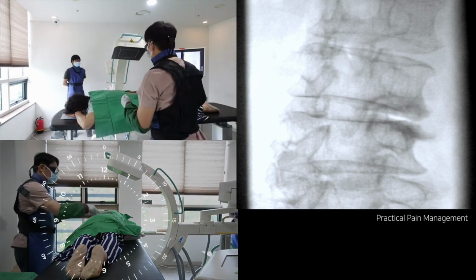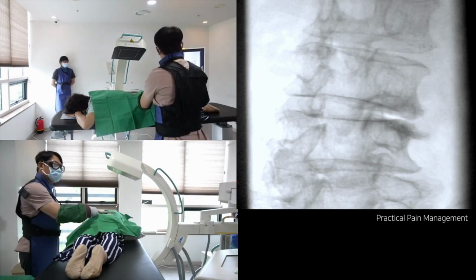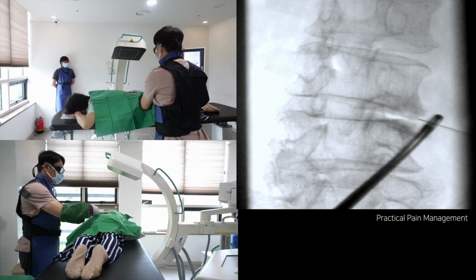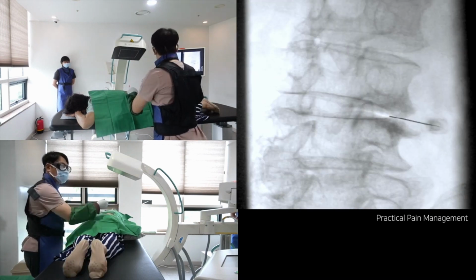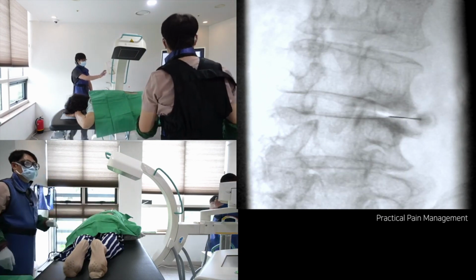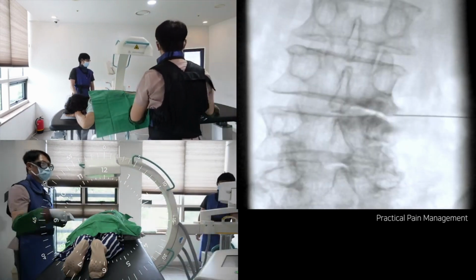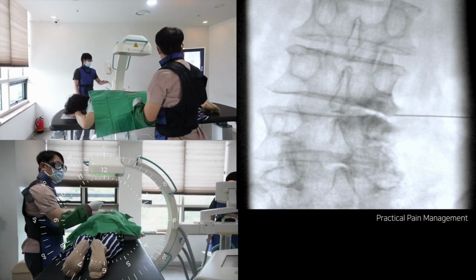The compass indicates a 30-degree rotation. I'll initiate the procedure by puncturing the skin at the right Kambin triangle. If there's a high risk of nerve root injury due to a severely narrowed ipsilateral foraminal space, I could approach from the opposite side. I request an AP view next. Then, I'll proceed slowly and meticulously to avoid harming the nerve root.